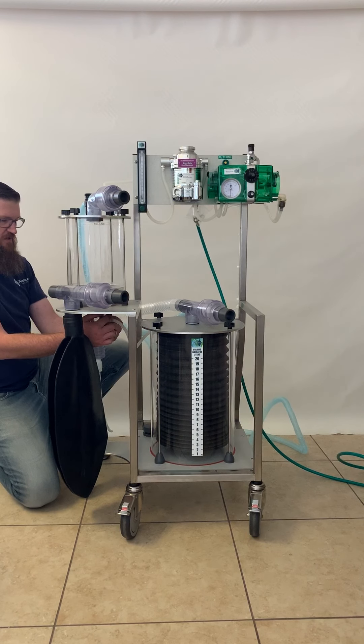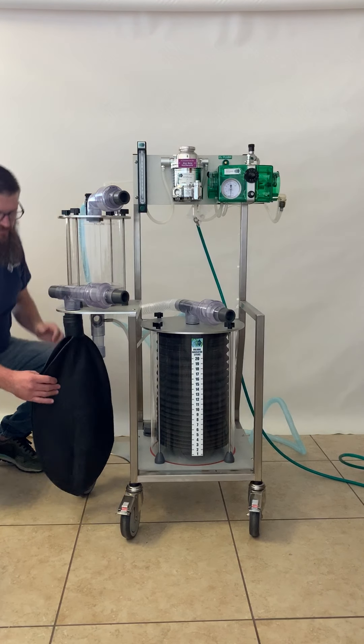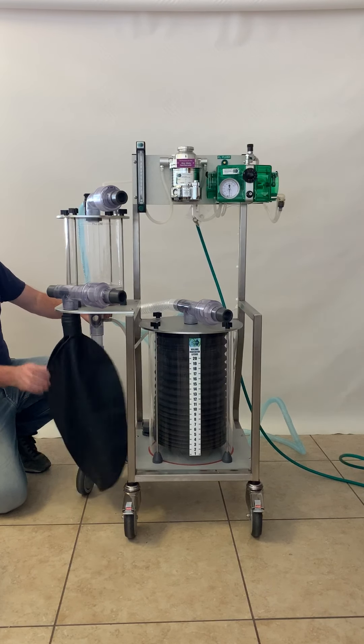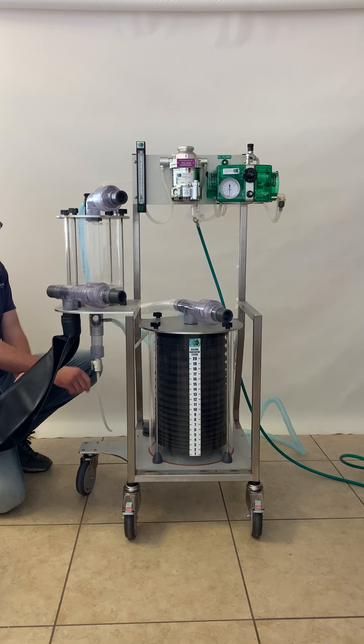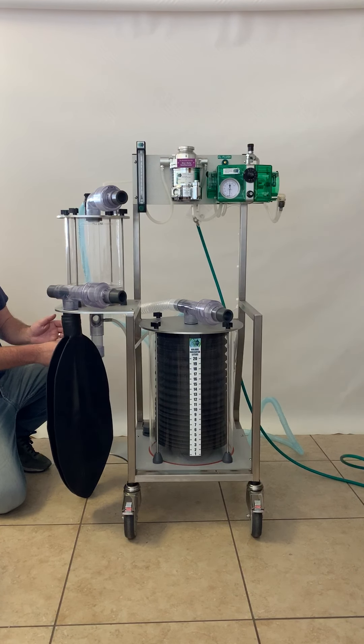The fresh gas with the isoflurane and oxygen comes in down below the absorber, and it goes to the bellows and to the patient through the inspiratory valve. The gas is then exhaled through the expiratory valve, down through the absorber, and back through the system. Down below the absorber is the moisture drain valve. This T down here will allow moisture to accumulate there instead of building up in the absorber. When this gets full of exhaled moisture, the valve can be opened to drain the liquid and then closed immediately thereafter.